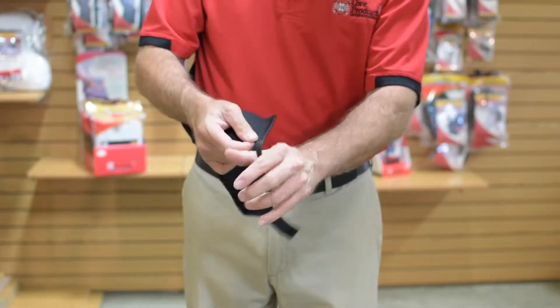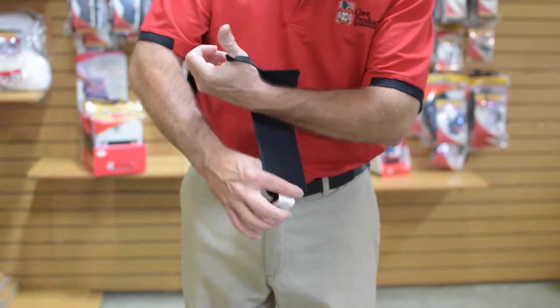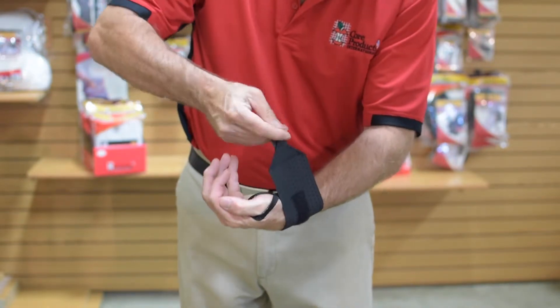Core products elastic wrist wrap with thumb loop is a universal wrap for mild carpal tunnel and other repetitive motion disorders.